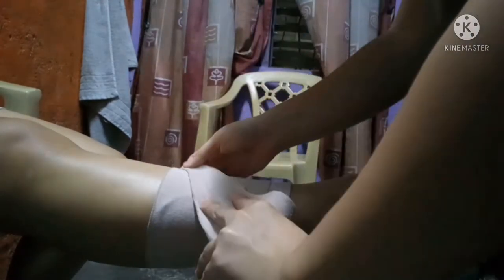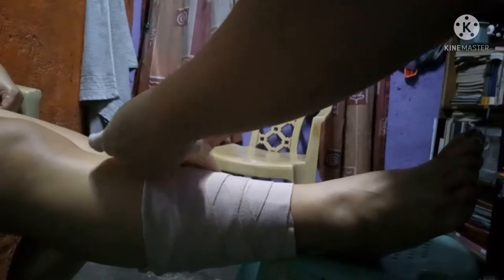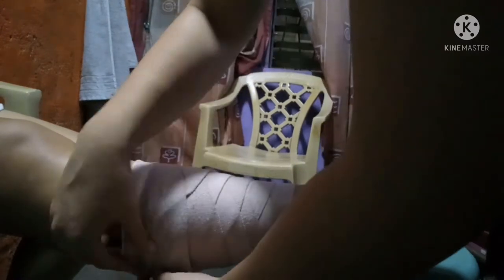Begin the bandage with two circular turns and bring the bandage upward at about a 30 degree angle. Place the thumb of the free hand on the upper edge of the bandage — the thumb will hold the bandage while it is folded on itself. Continue the bandage around the length, overlapping each previous turn by two-thirds the width of the bandage. Make each bandage turn at the same position on the limb so that the turns will be aligned. Terminate the bandage with two circular turns and secure the end as described for circular turns.